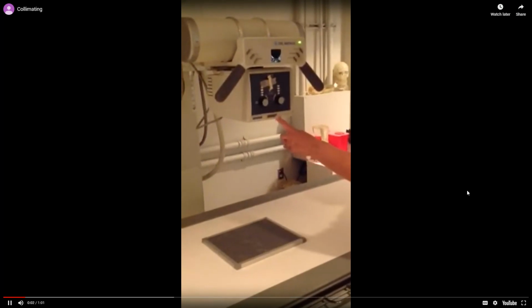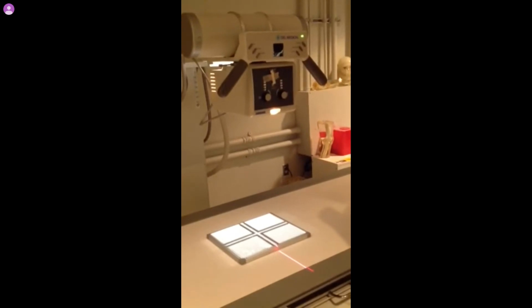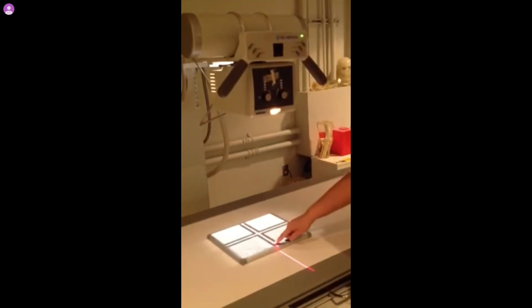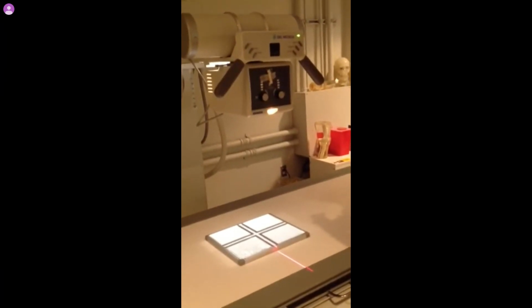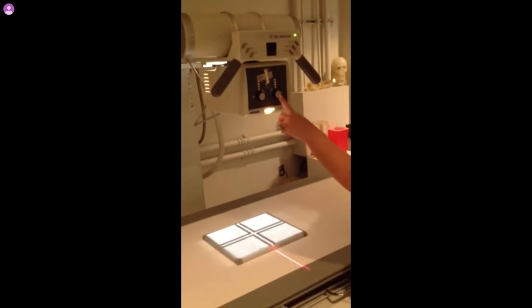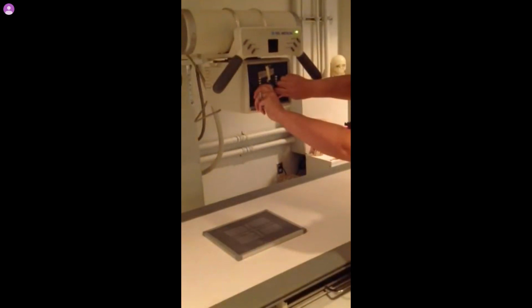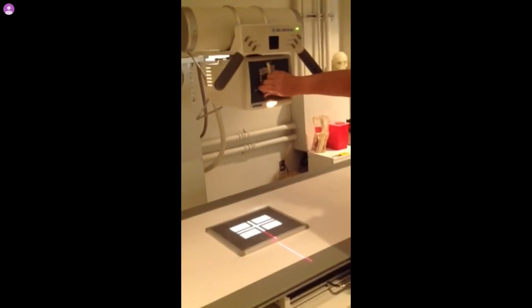What we're going to talk about is the one that turns on the light so that you can visualize where exactly your exposure is going to be coming across the patient. So when you hit this button right here, it's going to turn the light on and off. You will also notice that you have crosshairs in here, and that is going to be the center point of your X-ray beam. That's where we want to manipulate the exposure going through the patient in order to get diagnostic quality done. The last two set of buttons or knobs that we're going to talk about is going to be your collimator knobs. This allows the technologist to control the size of the light, and basically that is the point of exposure for the patient.